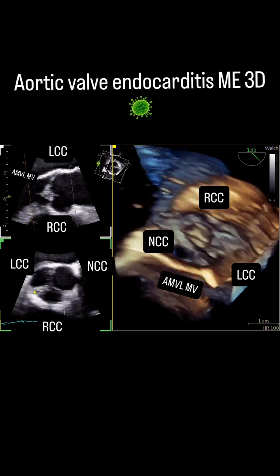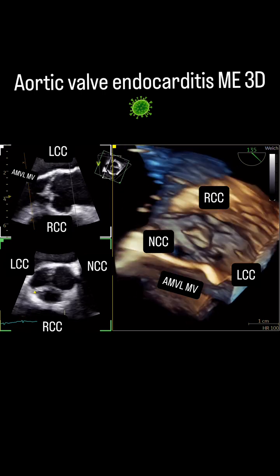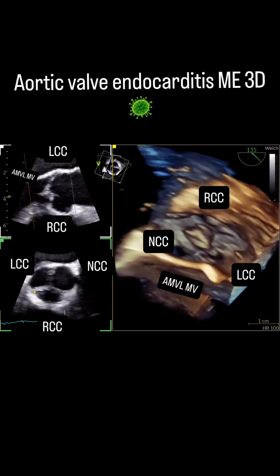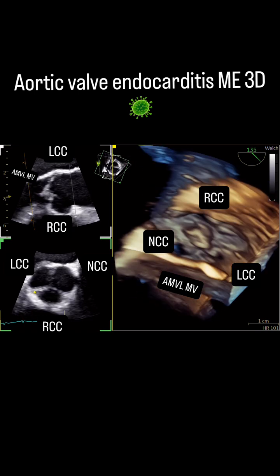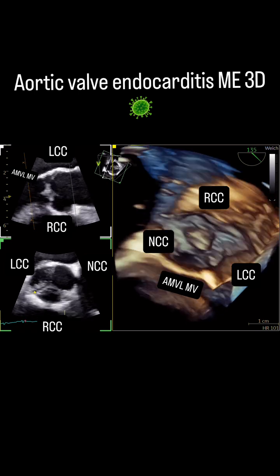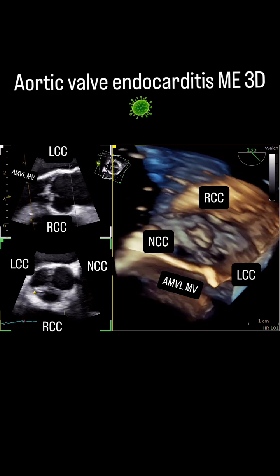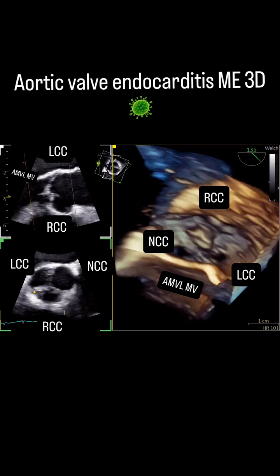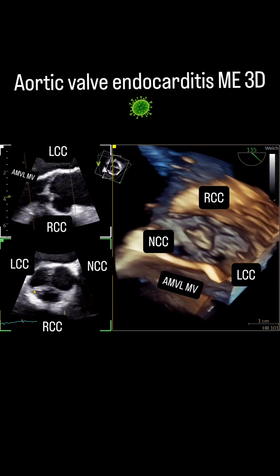You can see that the right coronary cusp has a smaller lesion overall, the non-coronary cusp has the biggest mobile lesion, and the left coronary cusp seems to be without any kind of endocarditis lesion.